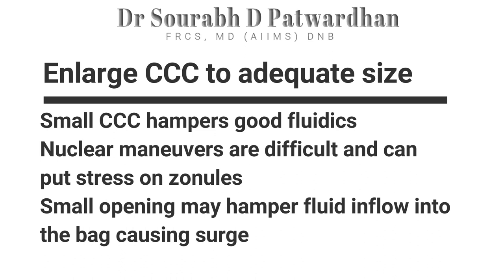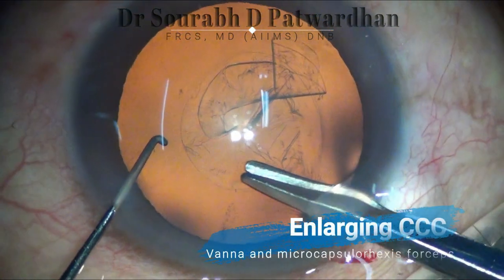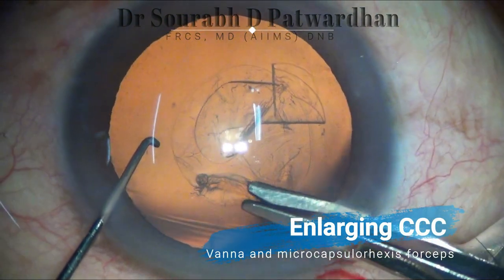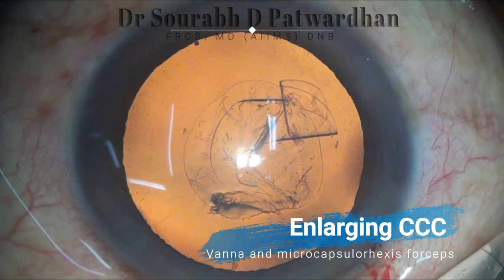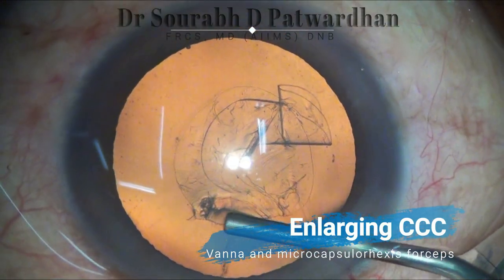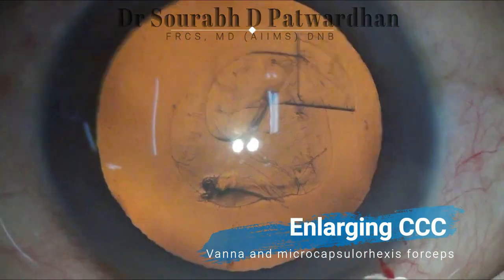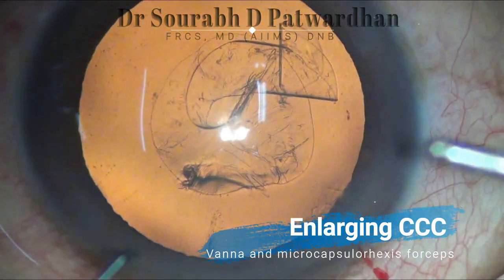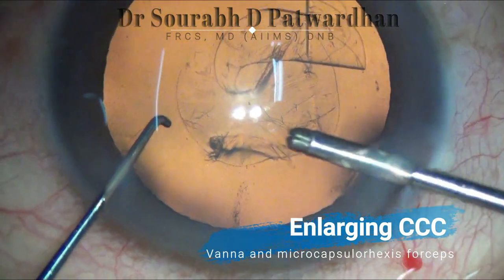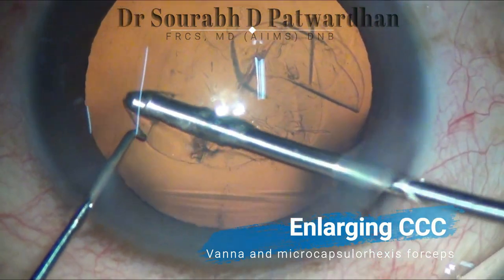The nuclear maneuvers are difficult and can put stress on zonules. How to enlarge the CCC? It is very simple. You can use either Vannas or microcapsulorrhexis scissors and make a tangential nick. Always try to make a tangential cut rather than radial, and then use viscoelastic to lift the tiny flap and use microcapsulorrhexis forceps to hold this tiny flap and enlarge the capsulorrhexis to the desired size. This is a very important maneuver which everyone must learn.